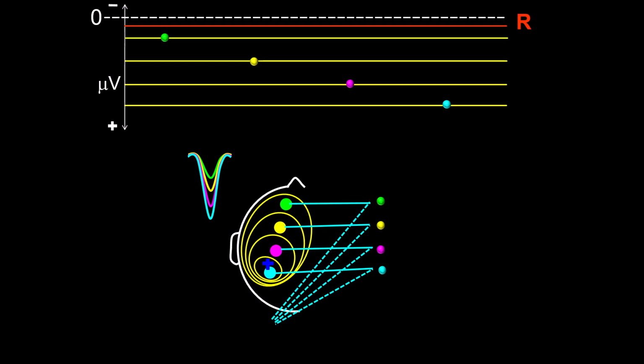Notice that the input 1 comes from the scalp, whereas in this case I am representing input 2 as a non-cephalic reference. This electrode is acting as the common reference electrode. I have now introduced a wave by the side of the reference electrode in the isopotential map. The polarity of the waveform, that is, the wave that is forming the common reference, is positive.